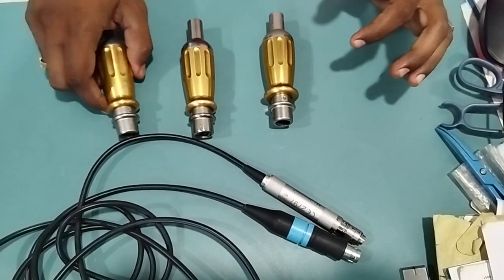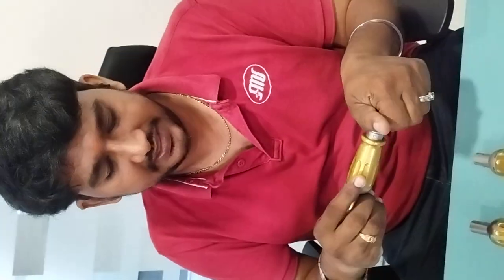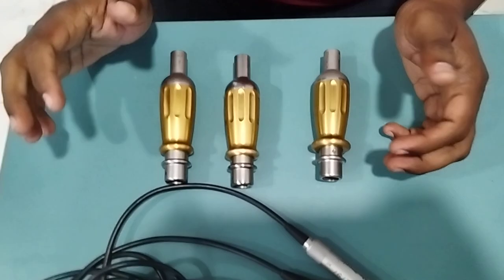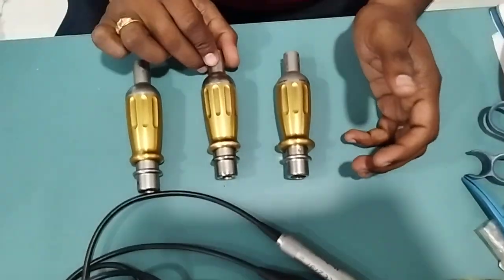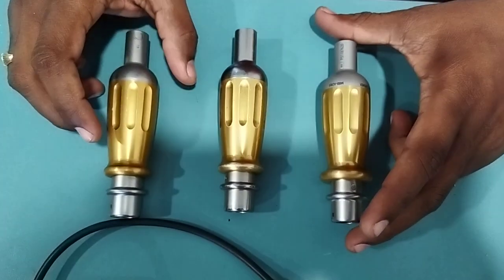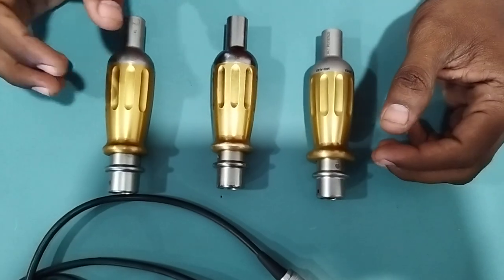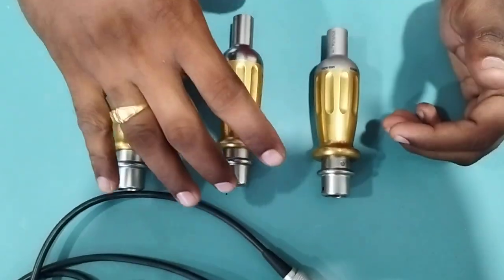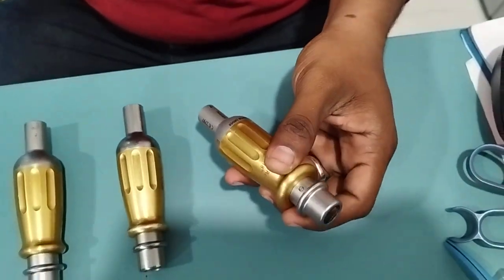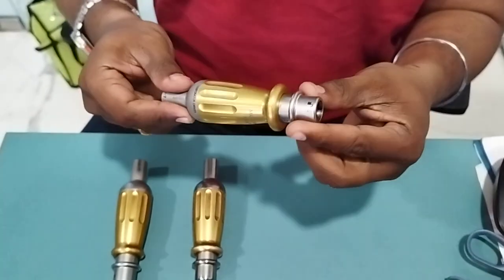Good evening friends. Today I received this attachment — we call it the perforator attachment AD03 from Medtronic. I have three units here; all are physically looking good. But I will tell you how to check this attachment internally, which is very important, because in so many places we supplied, customers had issues where the attachment looked fine physically but had internal problems.